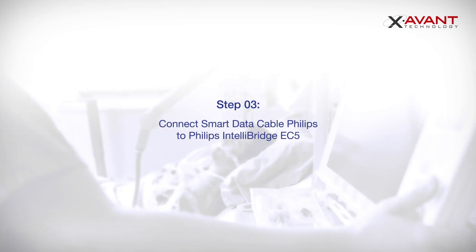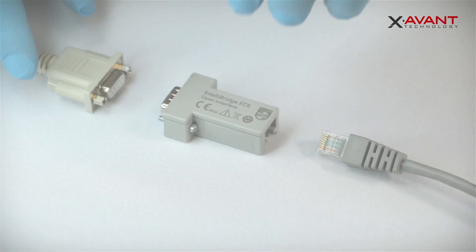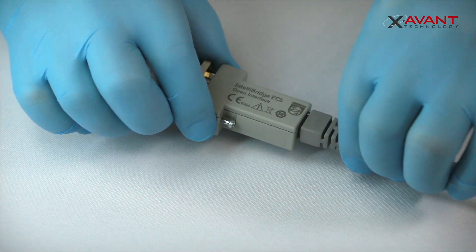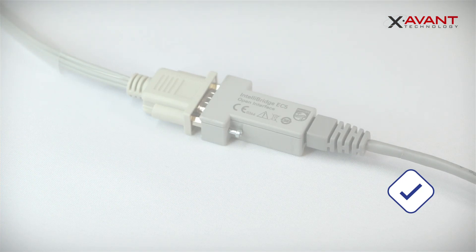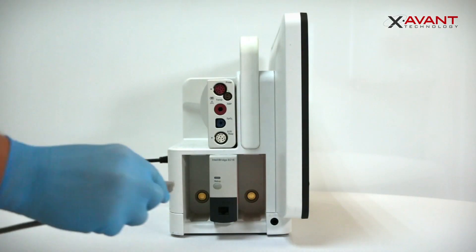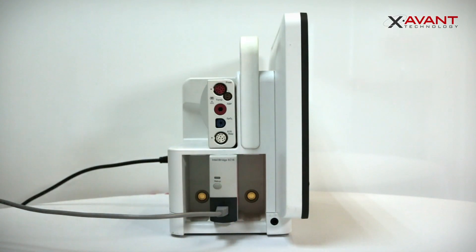Connect the Smart Data Cable Philips to the Philips IntelliBridge EC5 Module using the RS232 connector. Also connect the connection cable to the EC5 Module. Then connect the Philips EC5 Module to the Philips EC10 Module using the RJ45 Connection Cable.